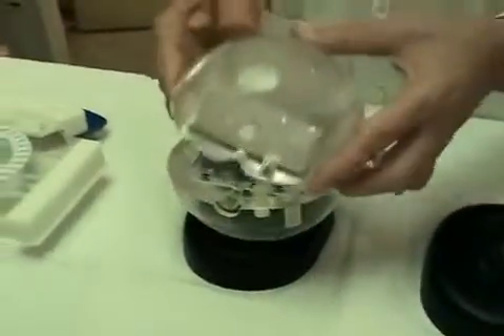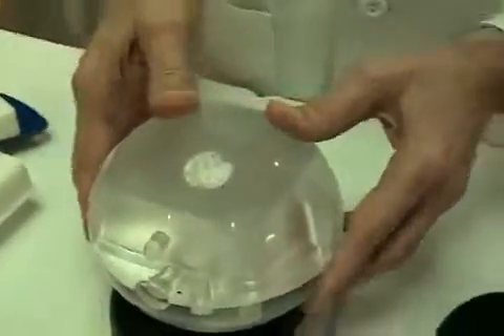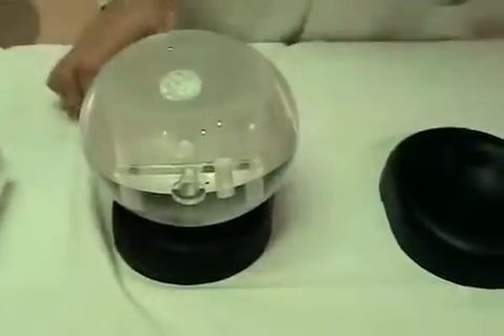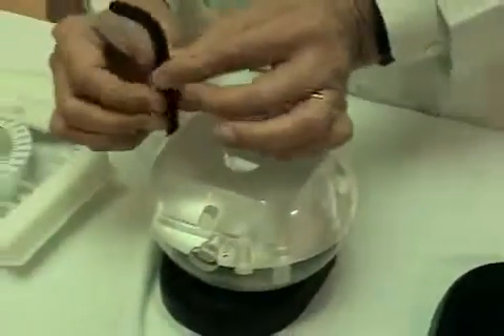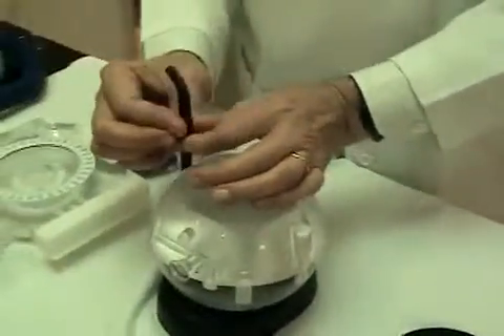Now we assemble the two halves — the two hemispheres — which are held together with two large nylon allen screws, which can be tightened with the provided allen wrench.